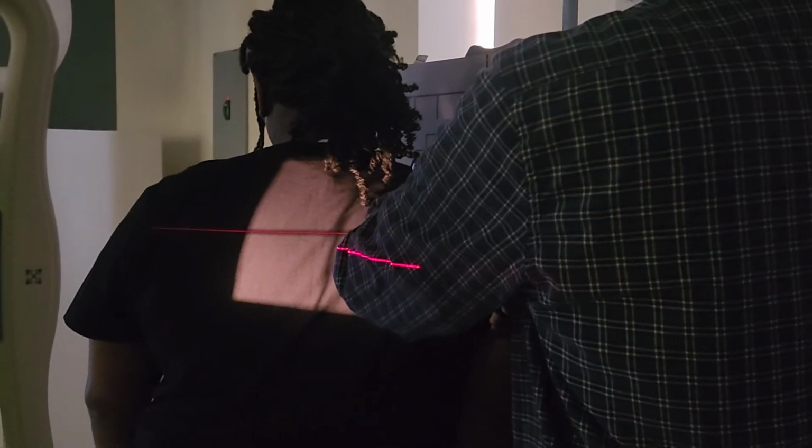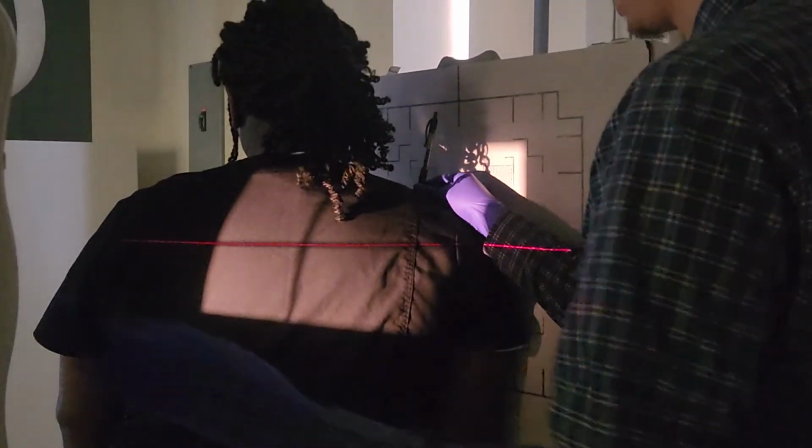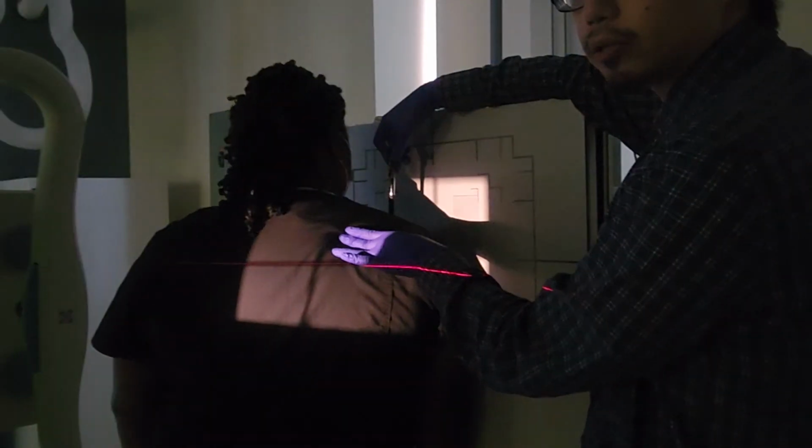But if I check the AC, which I just had, clavicle, you see. This is my AC on my central ray. This is my AC joint here on top of my central ray. No, it is not. Okay, so my superior border angle is, but not my AC joint.